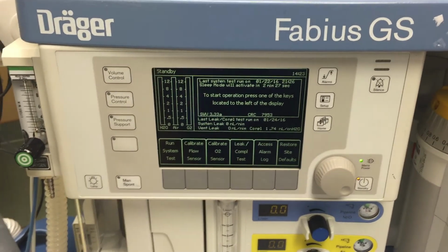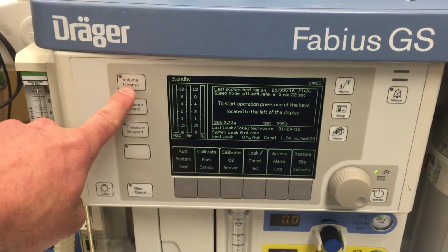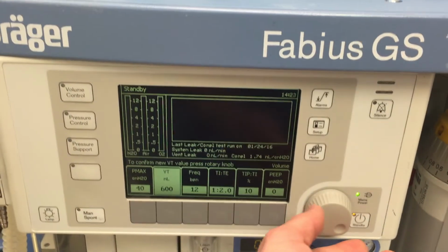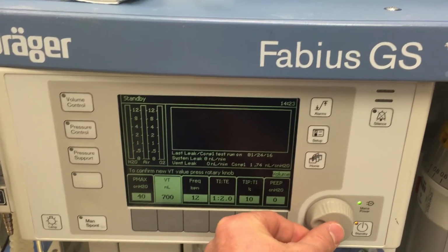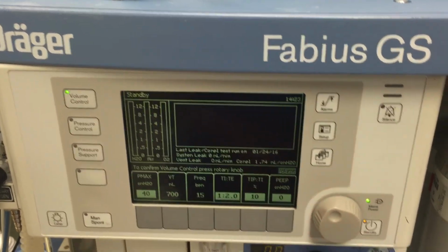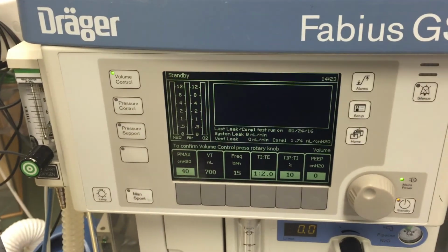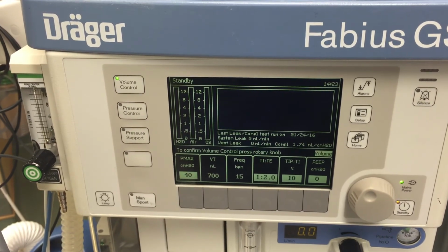When advising the clinician the ventilator settings for the NOVA technique, you want to recommend volume control and have them set a tidal volume above 700 mLs per breath. Also, you want a rate above 15. This will ensure that the patient is getting at least 700 mLs per breath at 15 breaths per minute.